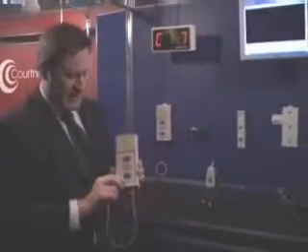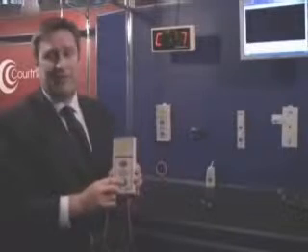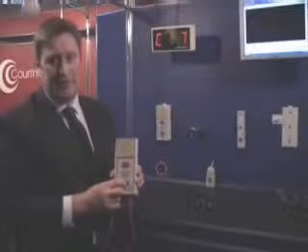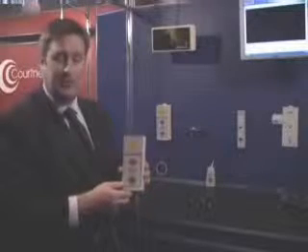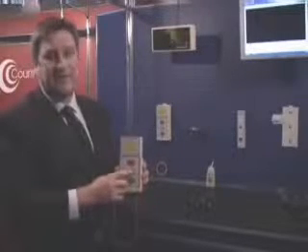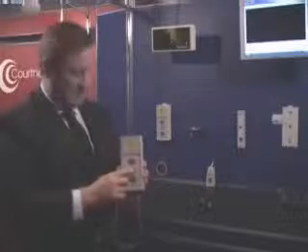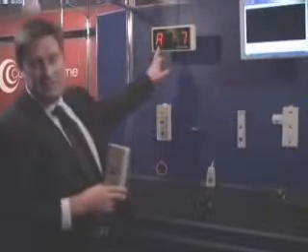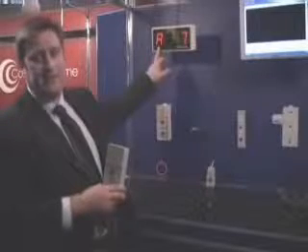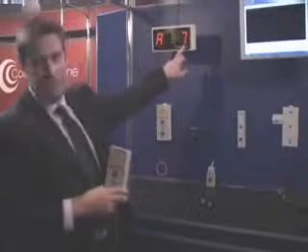Staff in 95% of the time will go and press the reset button at point of call, which is obviously a legal requirement. However, staff do have the option to use an assistance facility if they require other staff to attend to a problem in the room. In this case, assistance is now showing on the panel. There is now a faster tone and it's showing assistance on room 7.